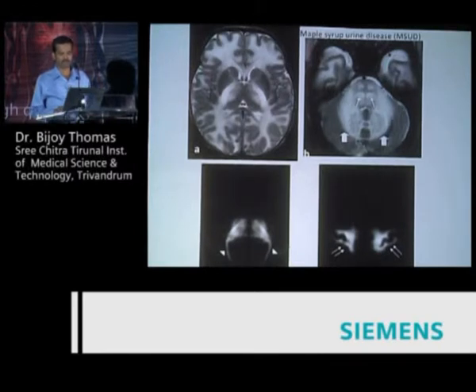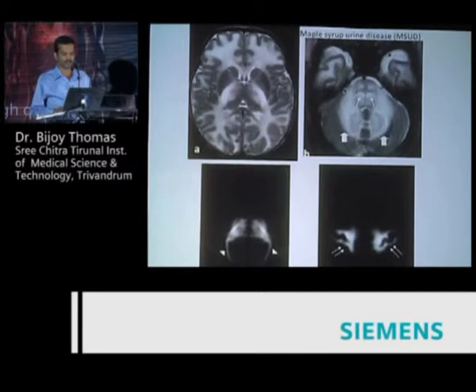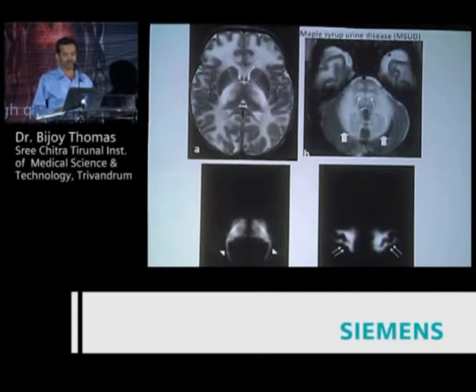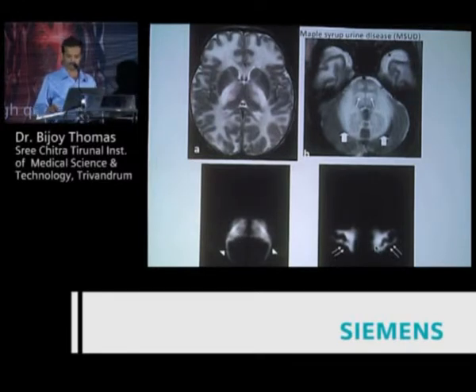You can see the white matter of the cerebellum appearing swollen. The posterior dorsal tracts are hyperintense, the corticospinal tracts are hyperintense, and you can see spared areas with myelin edema. The posterior limb of the internal capsule is swollen. You can see restricted diffusion in the already myelinated—now demyelinating—areas: the posterior thalamic radiations, optic radiations, thalamus, and corticospinal tract. If you see this combination, practically there is no other differential diagnosis other than maple syrup urine disease.